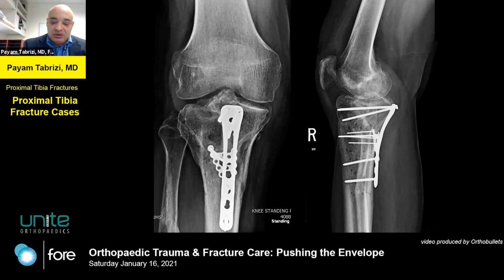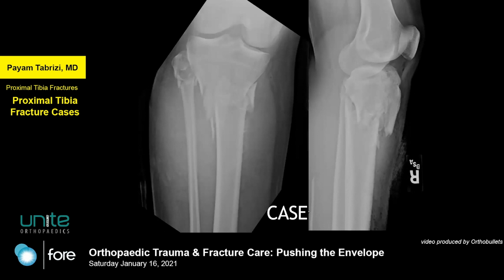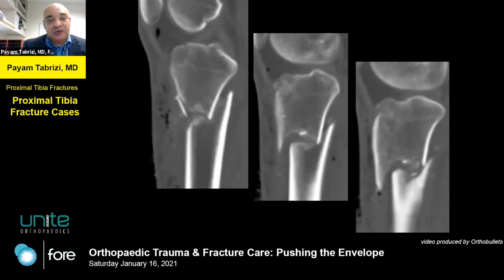Yep. So this is a case from a colleague. It's a relatively older patient who had a mechanical fall and sustained this osteoporotic type fracture. It looks like it's extra-articular, but it's hard to tell. It looks like it's mostly metaphyseal, but with a lot of comminution and a lot of instability. So whenever I see any fracture close to a joint, I always get a CT because I've been fooled thinking it's all extra-articular. And this fracture does go into the joint.